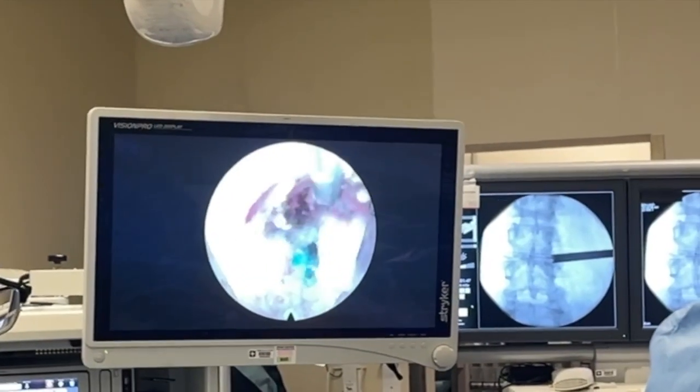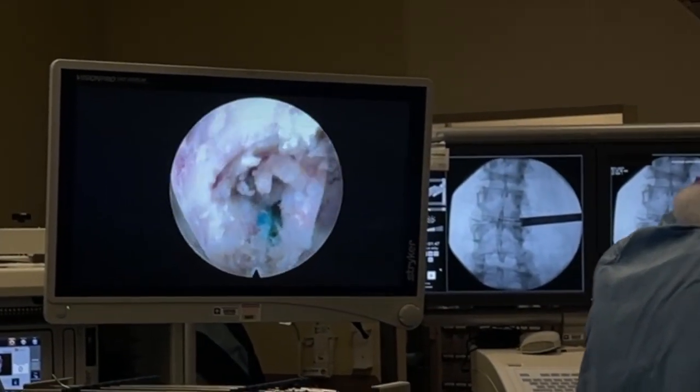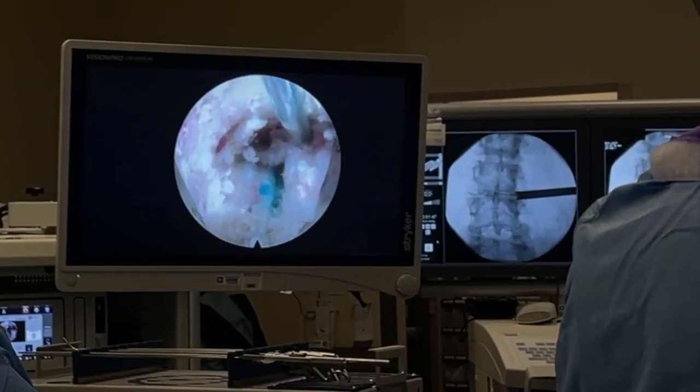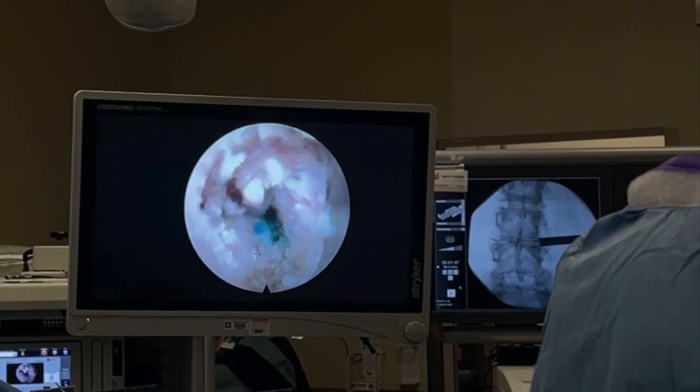Okay, so now I got that bump off. That's the bone spur remnant. And now you can see the fat coming in. Look at it, it's pulsating. Kinda cool. Feeling good about this. I can get this easily in now. Now I can do the next level. That went really well. I'm very happy so far.